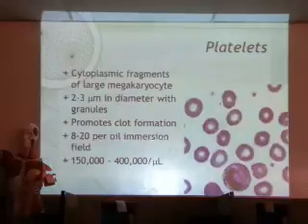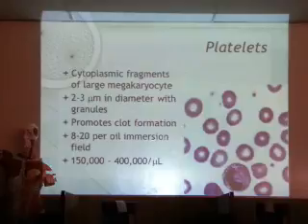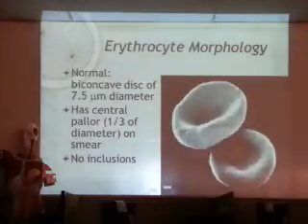And in the old days, my days, we used to have to learn how to count those cells on the microscope manually, click, click, click. Of course, we don't count a million cells, so we dilute the sample, so we only count maybe a few hundred. But still, after a day of doing that, you can cross your eyes. Anyway, so platelets in circulation, 150,000 to 400,000. So we can do an estimate, and that's part of the differential pattern.